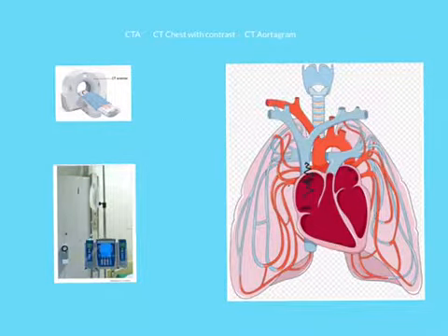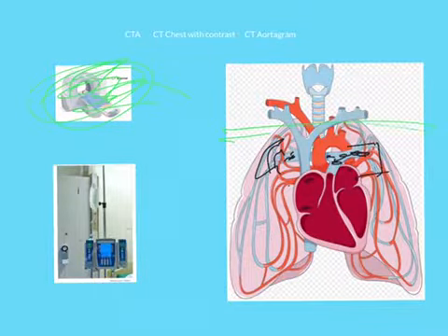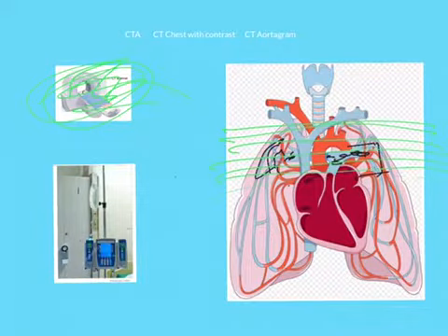It's pretty much out of there, and now it lies inside the right atrium and the right ventricle. And it's going to continue to move along over here through the pulmonary arteries. Now it moves along into the pulmonary arteries, here and here and here. And it's in the pulmonary arteries, which is what you're concerned about when you're looking for a pulmonary embolus. So when the contrast is in that area, in the pulmonary arteries, that's when you fire up the CAT scanner, and that's when you start taking slices through that area.